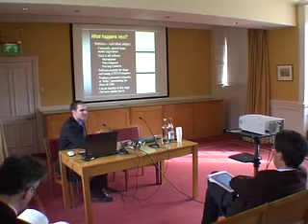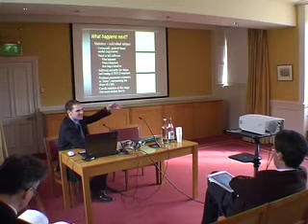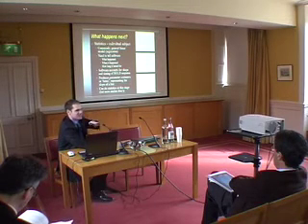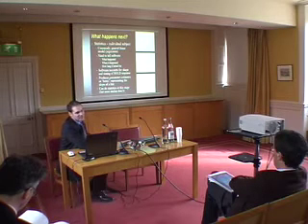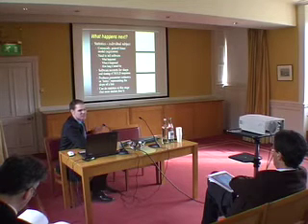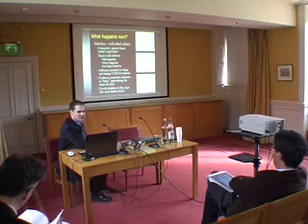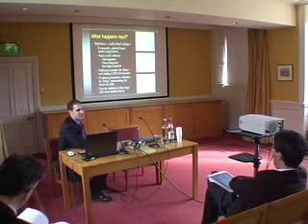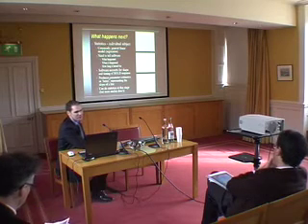In particular, it accounts for this slow time course of the BOLD response. So remember, the BOLD response takes 6 seconds to peak and 16 to 32 seconds to come back down to baseline. So there's a complex set of statistical procedures in order to take that into account. And what we actually get at the end are what are called parameter estimates. So this is the statistics bit. So let's just go through that very quickly.